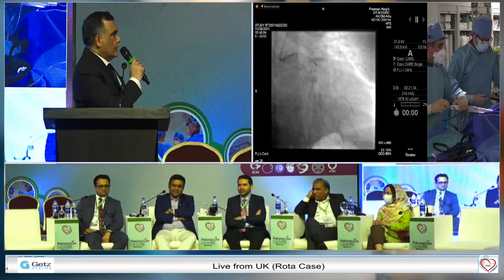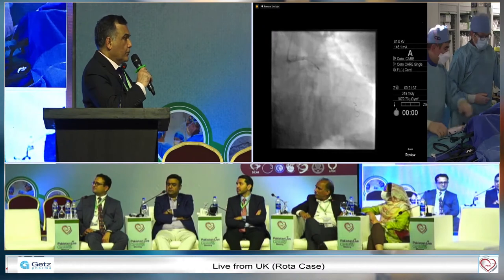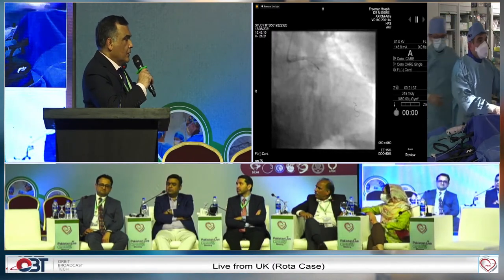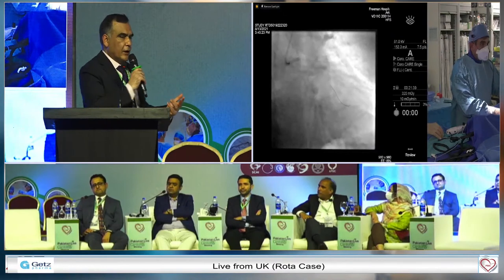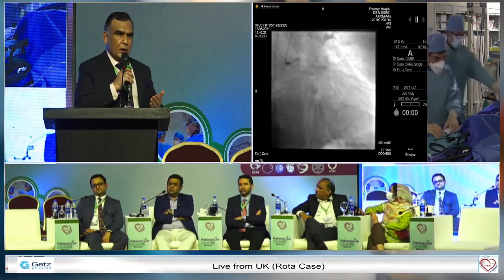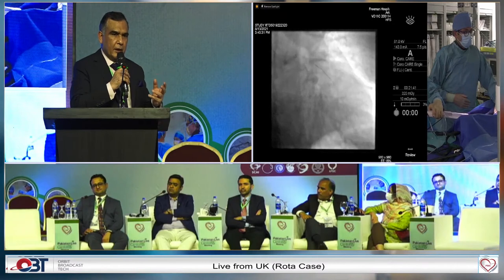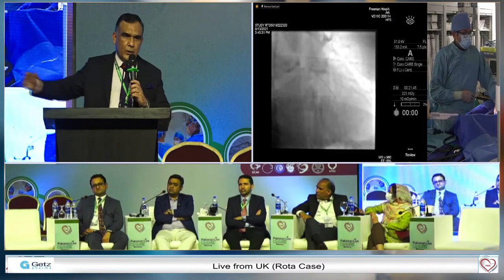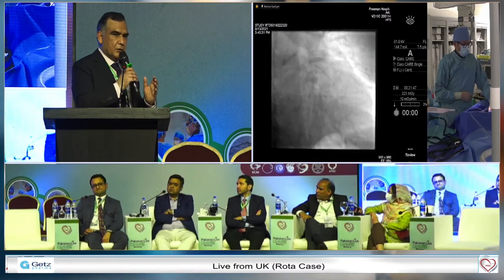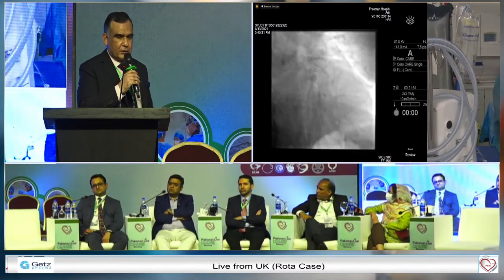I think as a strategy for Pakistan, people shy away from rotablation because of various risks. Yeah, that's very true. The more you do it, the easier it gets. That's why when teaching the fellows, I try to tell them that they should get used to not going forward in DynaGlide, because otherwise people are not used to over-the-wire balloons and holding the wires at arm's length. So I think first they learn it the proper way, and then they can use the tricks.